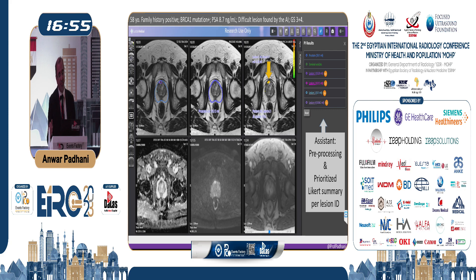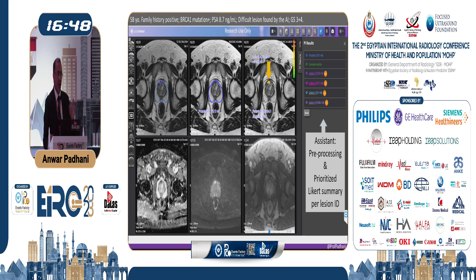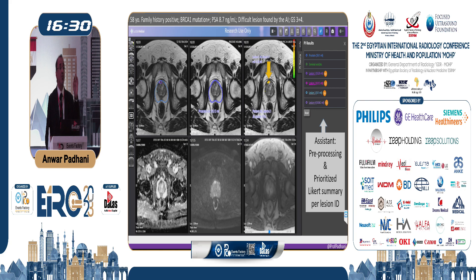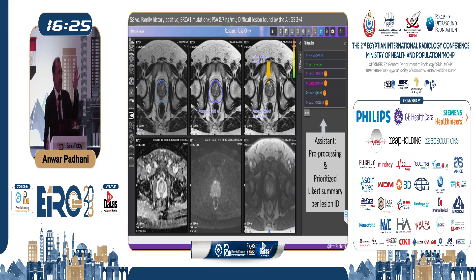Here is an AI that I sometimes use. You can see the arrow on the T2 image with the color image showing a very subtle PIRADS 4 lesion anteriorly in the transition zone. This software is an assistant because it pre-processes the images even before you see them. The AI identifies three lesions, and for each lesion it gives a PIRADS score.